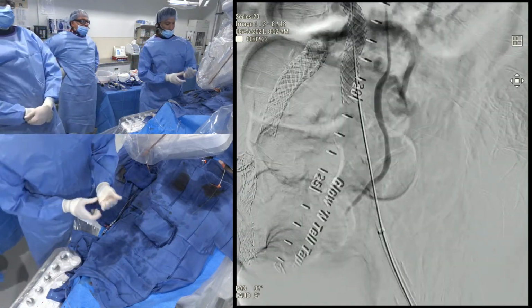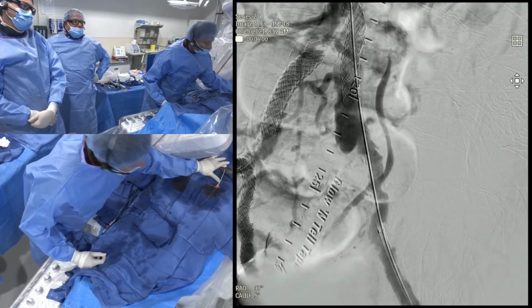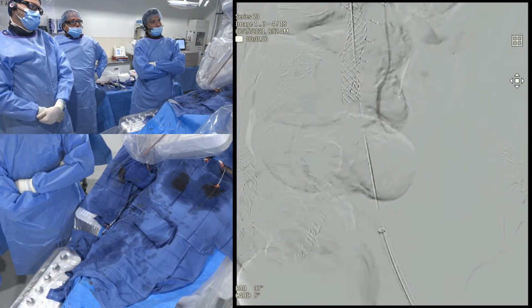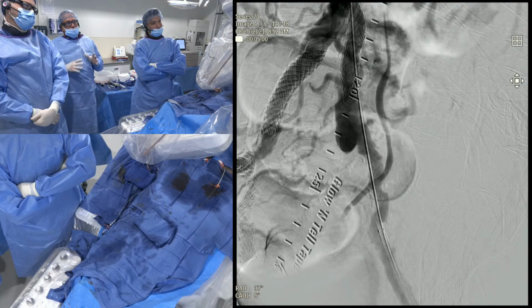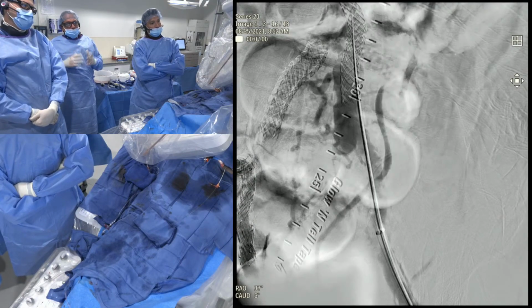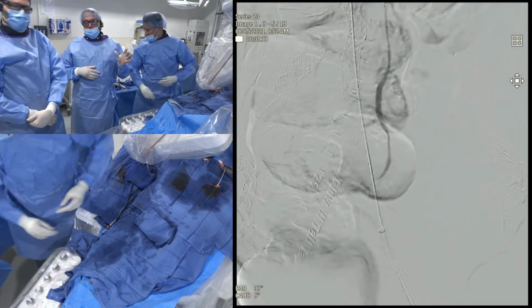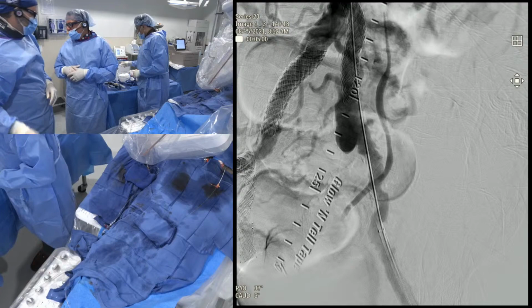This is also going to anchor this, and this is part of the reason why Luke was very careful pulling the balloon out, because obviously the distal stent is not anchored. You really have to ensure that the balloon comes down as you pull it out, because if the balloon is flailed open, then it may actually capture part of the stent, even though it's a covered stent, and just move it down, which is what you don't want. So now, actually 10-0 first.